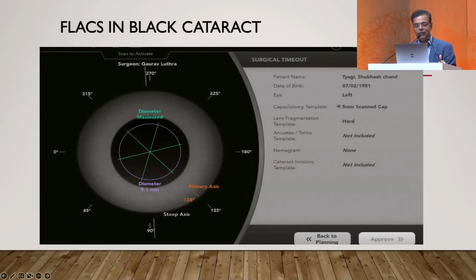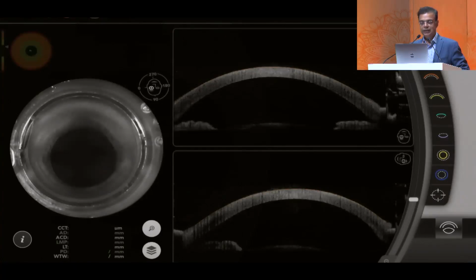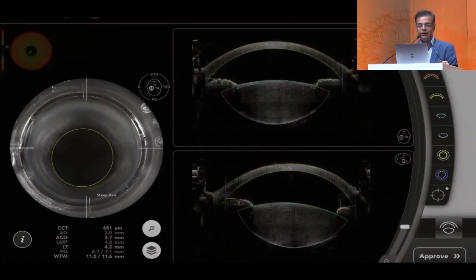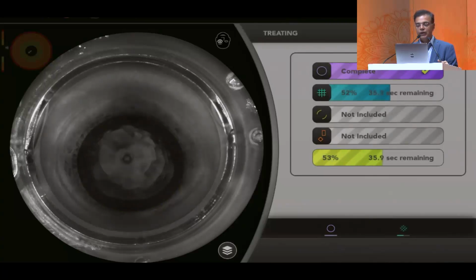Now another indication where I think that hard brown black cataracts have a great benefit from laser assisted cataract surgery, because these are not opaque cataracts. So these are those hard brown black cataracts where you can still possibly see a glimpse of the fundus, and you can see that the situation here is a significantly dense cataract. And you can then plan your fragmentation using several different techniques. You can have a double pass of the energy. You can have closer spot size, or various ways to do that. And you can even do the fragmentation using the grid pattern.